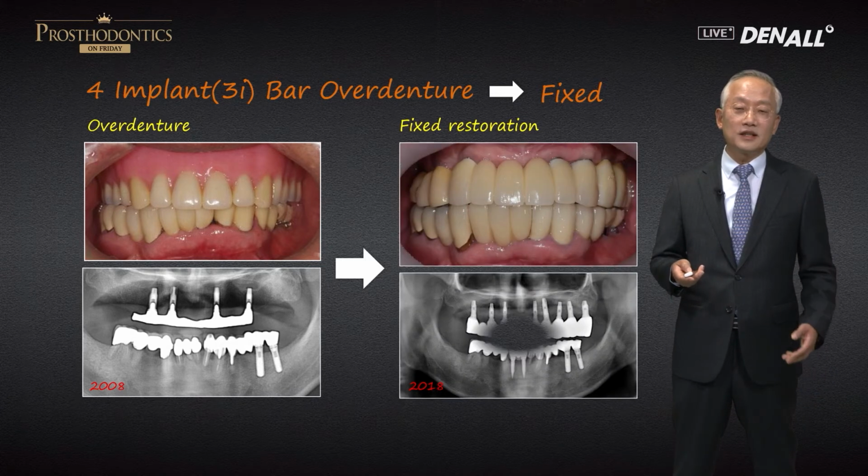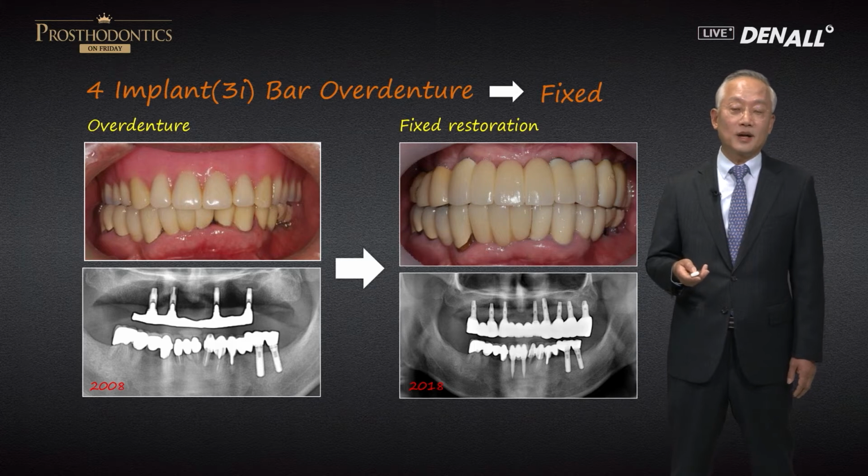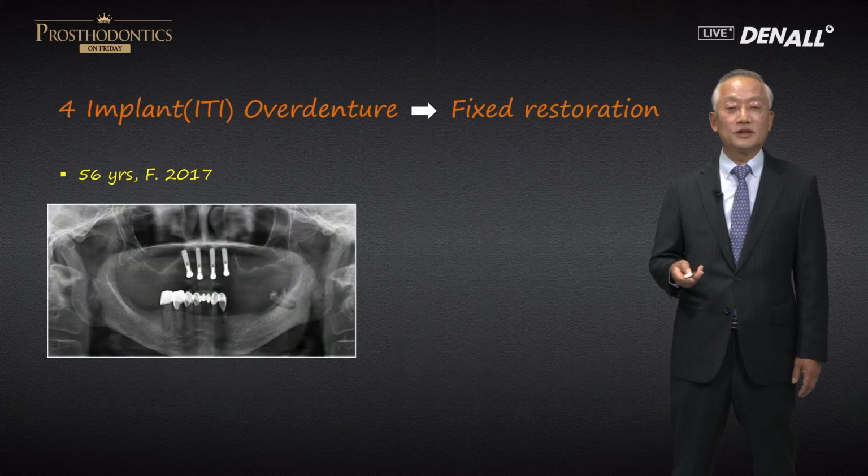And one day he came and said he wanted a fixed restoration. We added 4 more implants and changed the restoration to fixed type. The patient was very satisfied and even to this day continues to use it.